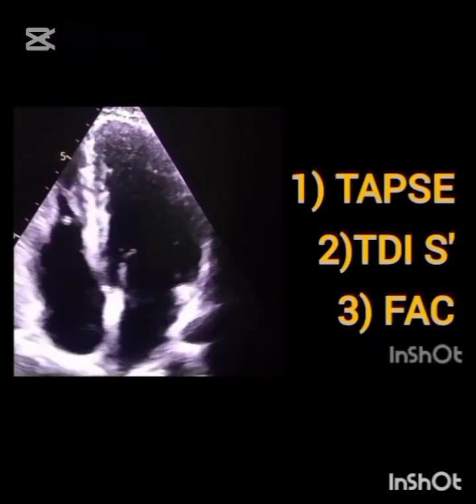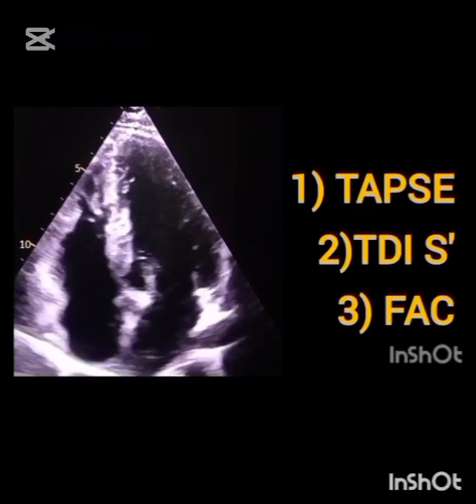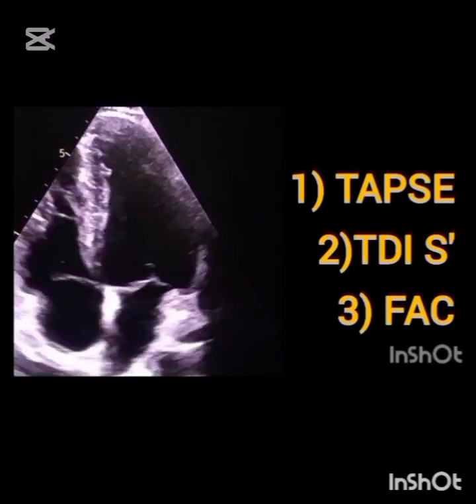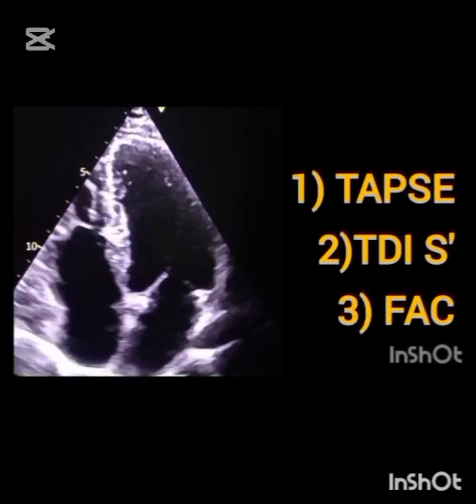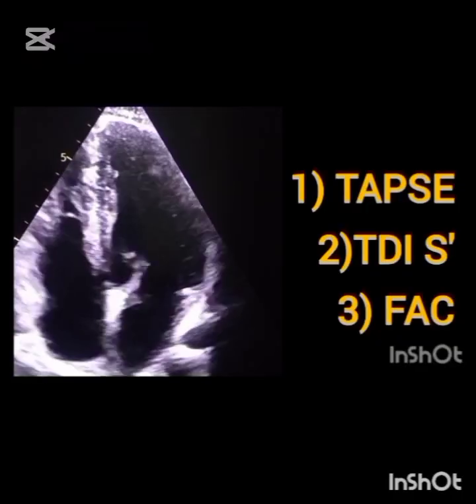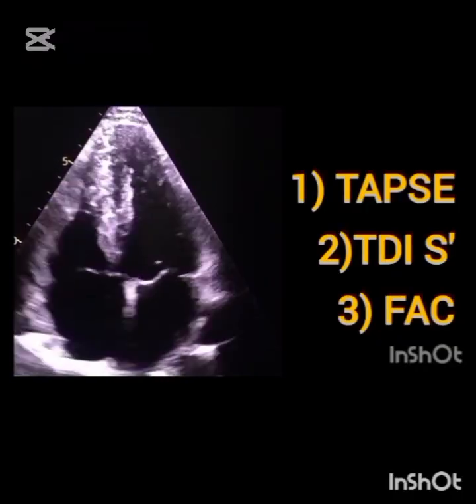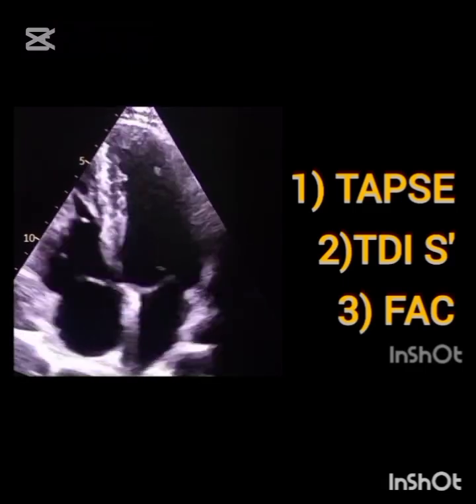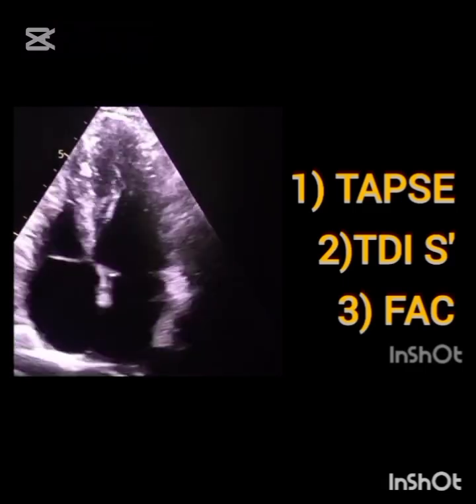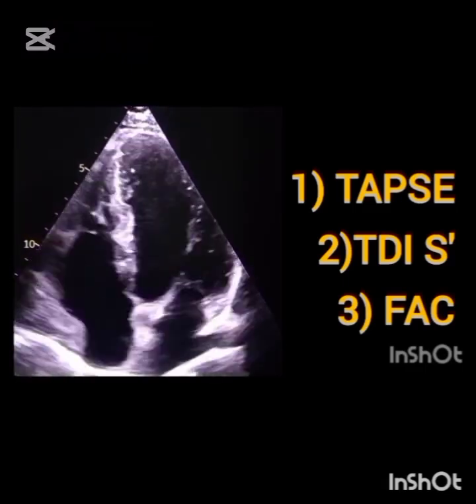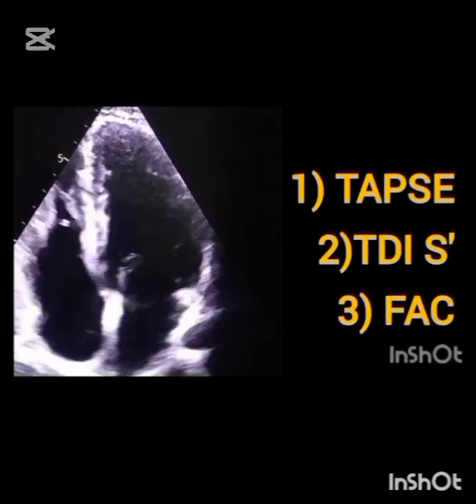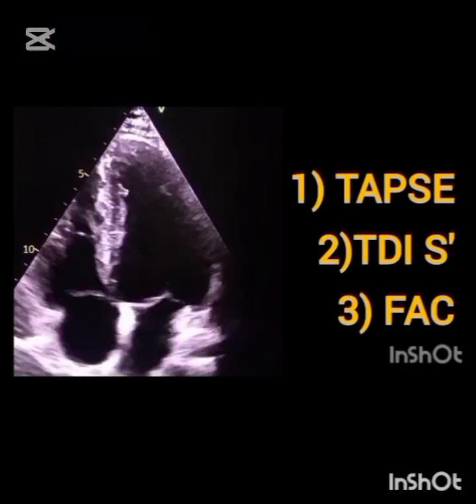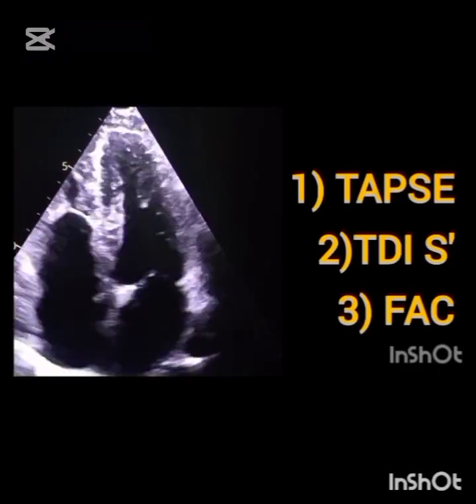This is the easy way to measure the RV diameter accurately. Now let's look at quantitative parameters of right ventricle systolic assessment. The quantitative parameters of the right ventricle are: Number 1 — TAPSE, tricuspid annular plane systolic excursion; Number 2 — tissue Doppler imaging S' wave; Number 3 — FAC, fractional area change. Let's see one by one how each is measured.